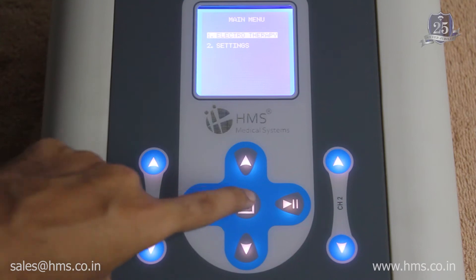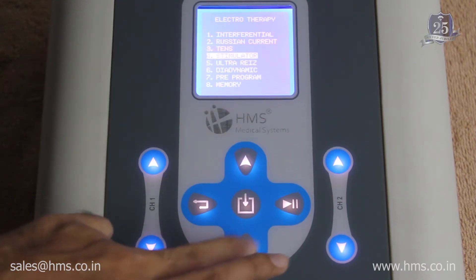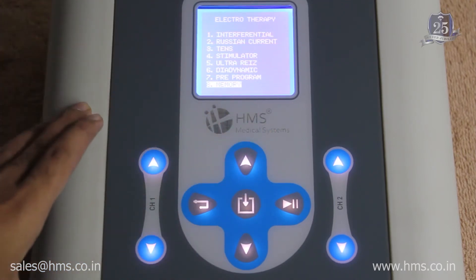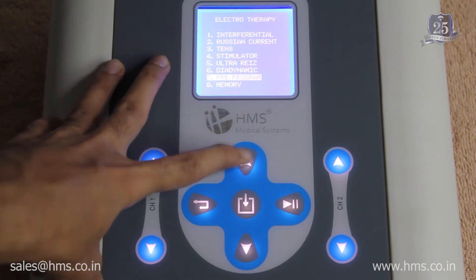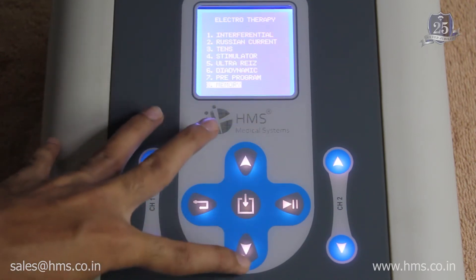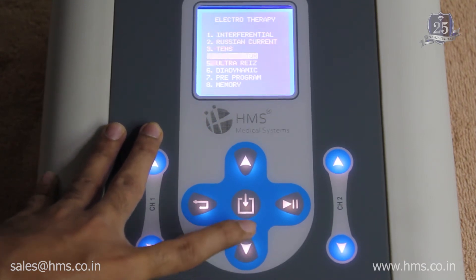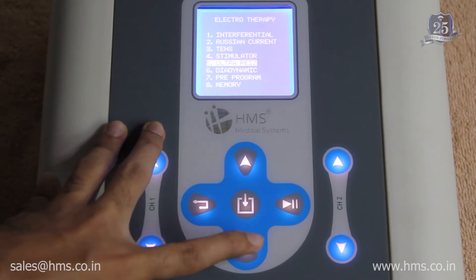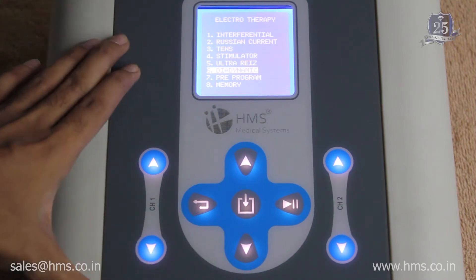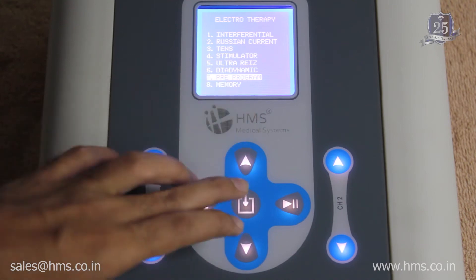Going into electrotherapy, there are six different modalities available. This machine is actually a combination of electrotherapy modalities. The six modalities are: IFT, Russian current, TENS, stimulator, Ultra Reiz, and diadynamic. There is also a seventh option — pre-programs.